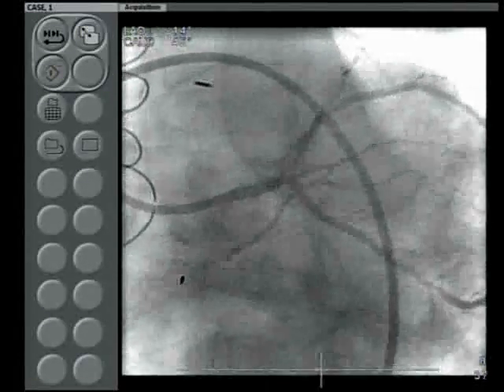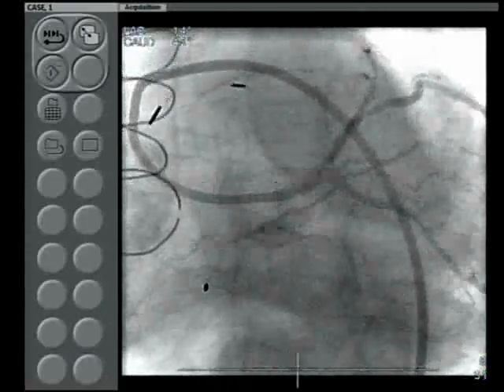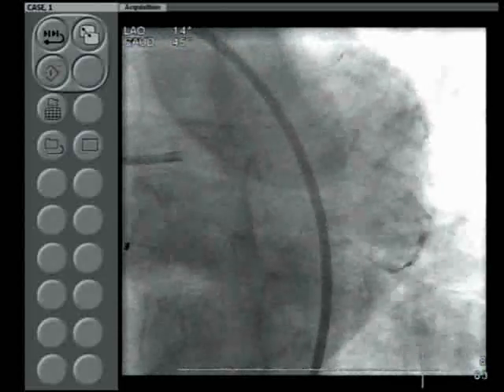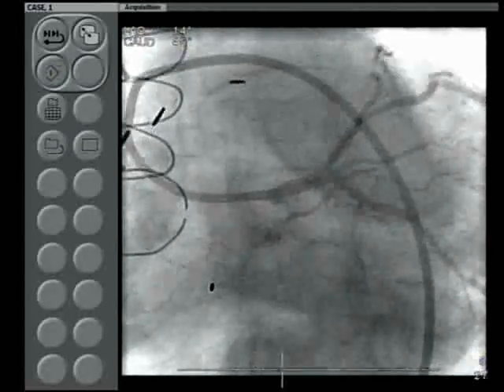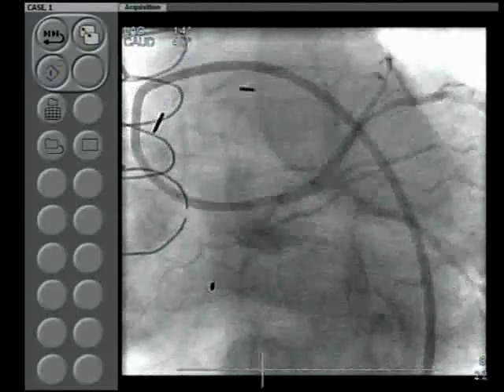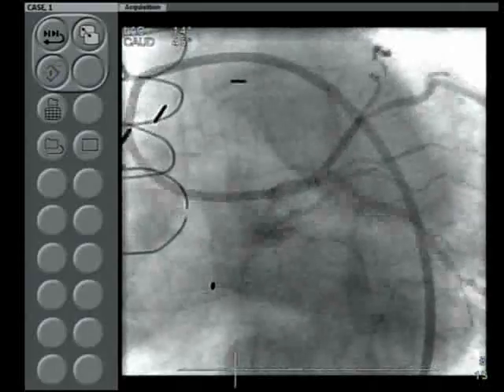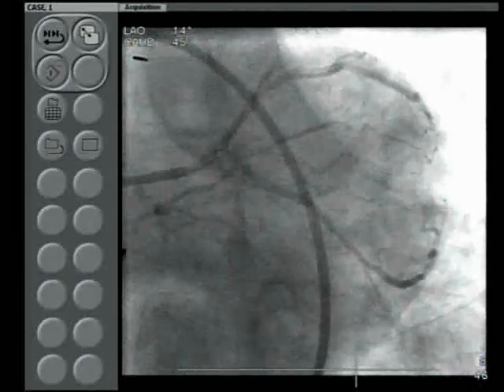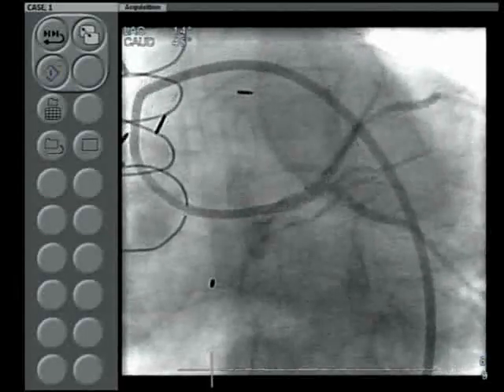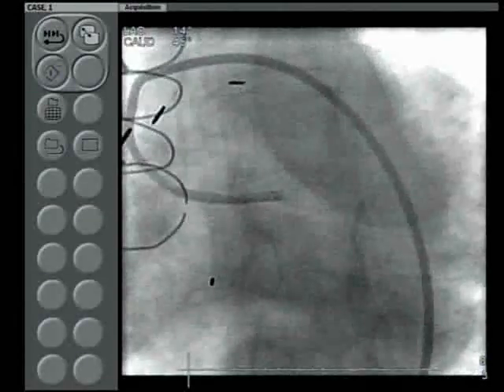And what is your overall analysis on the angiogram? Yeah, I think going with what Dr. Sharma just mentioned, the distal left main is probably moderate. Angiographically, we could say maybe 50%, but the majority of the disease is in the ostial LAD, and maybe less than 50% even in the ostial circumflex.